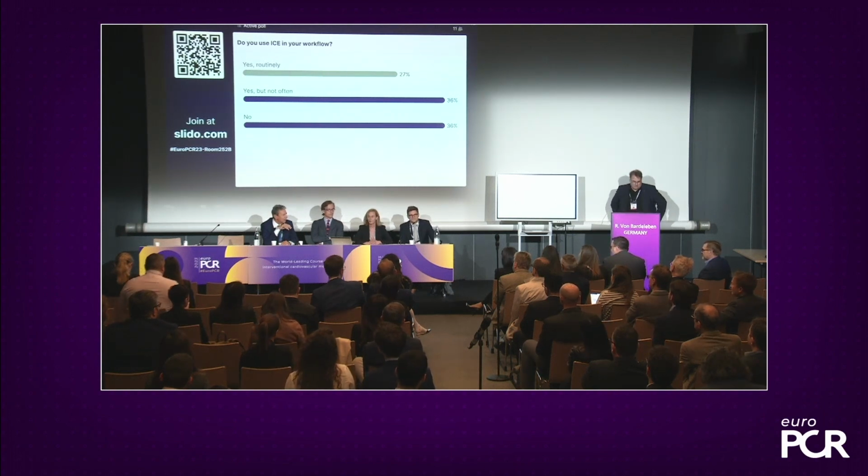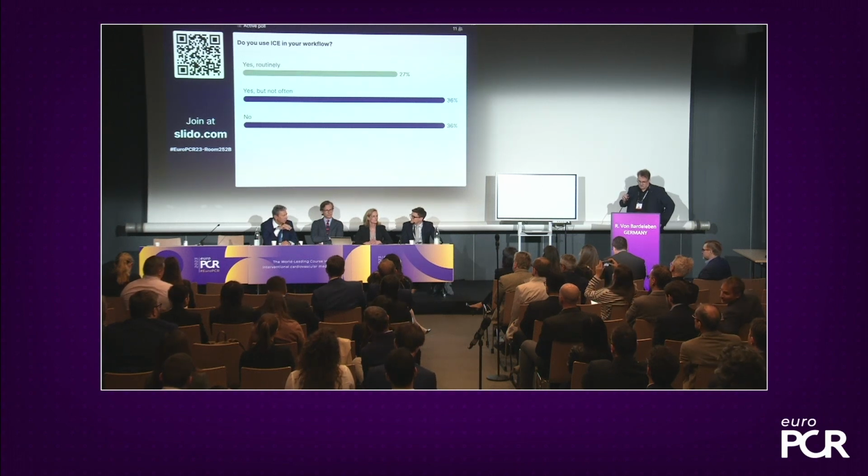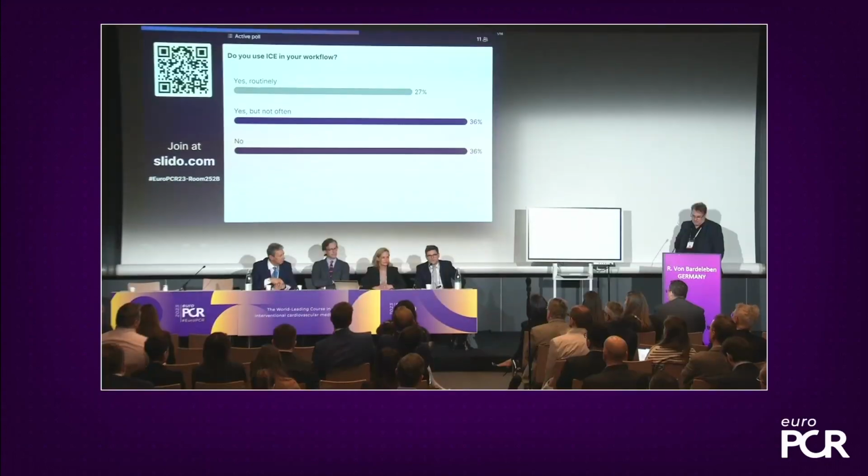Yeah, I know, maybe in Sweden, I think. I'm not too sure, but I think there are some countries in Europe where it's possible to do it. You can do it maximum 1 or 2 times because after that the quality of the image deteriorates. But I'm not sure, probably in Sweden. Generally I think it's not the case, but there may be some exception. So you have to use it for every patient again and again.